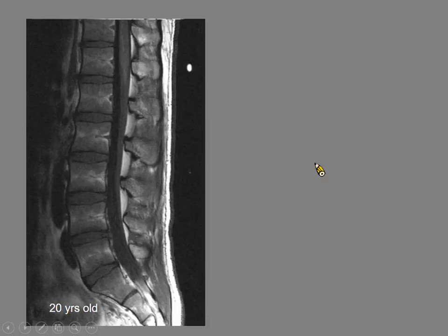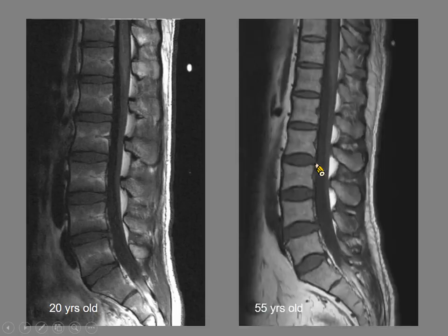On the other hand, if you look at the spine in an older patient, you find that it has a high T1 weighted signal compared to a younger patient. And this difference is even more marked when you look at certain parts of the skeleton, such as the pelvis.